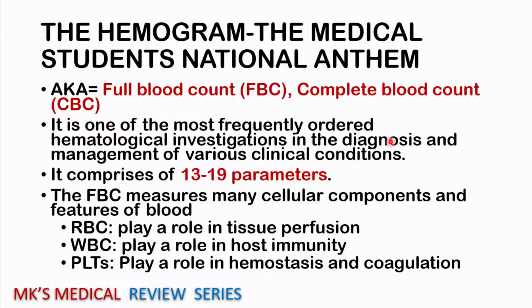Today we're going to be focusing mainly on the hemogram, or what I love to call the medical students' national anthem. The reason why I refer to it as this is because when you ask students what one investigation they would order for, over 50% of medical students usually go for a full blood count or a complete blood count, or they say hemogram. So remember that the hemogram can also be referred to as a full blood count or FBC, which is what we shall be using to refer to it in the rest of this lecture. It can also be referred to as a complete blood count.